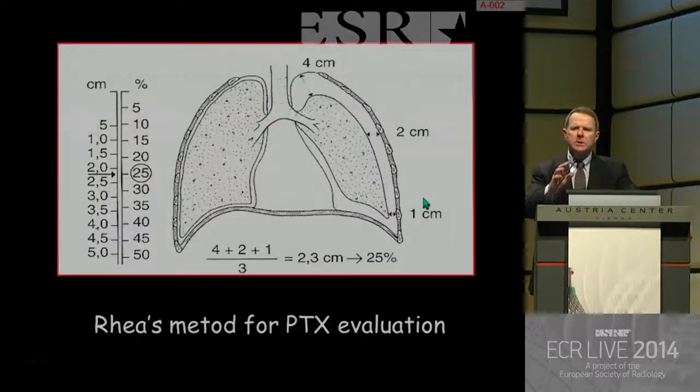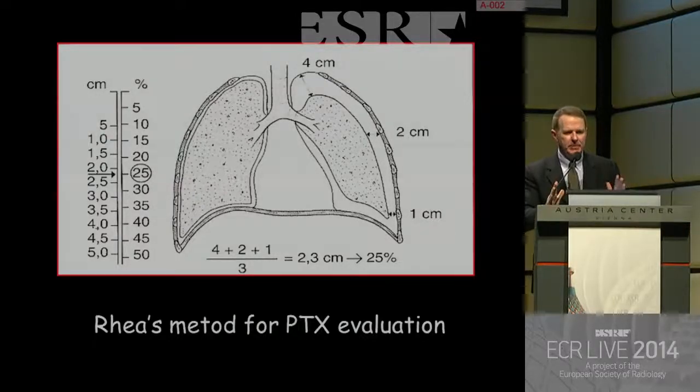How do you judge the pneumothorax? I guess that all of you know this slide. Remember, anytime that you have a pneumothorax, at least what I do, if I have the pneumothorax in CT, and I have made a diagnosis of pneumothorax in CT, then I take a chest X-ray. Because we try to do all the lung biopsies in the morning. In the afternoon, or the morning after, somebody will do another chest X-ray to check the pneumothorax. So it's better to have a baseline pneumothorax after the end of your biopsy, rather than having somebody else guessing has increased, has not increased.